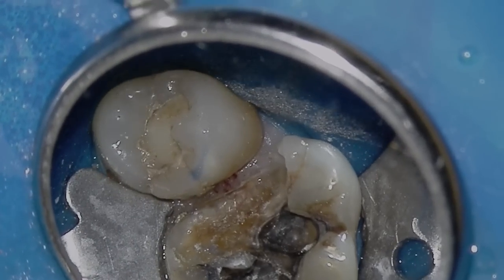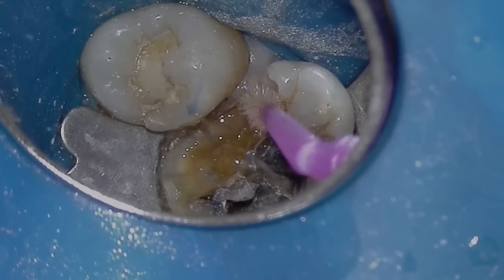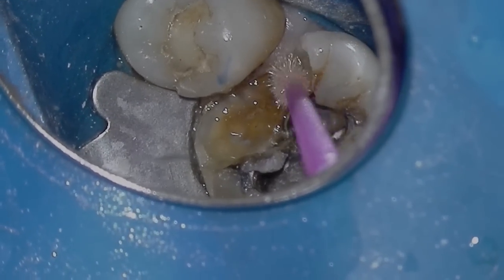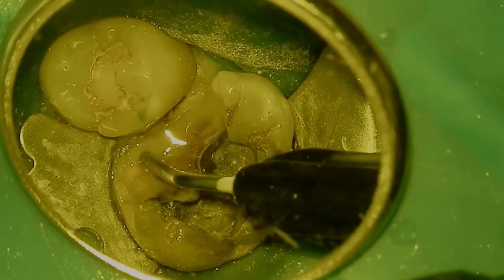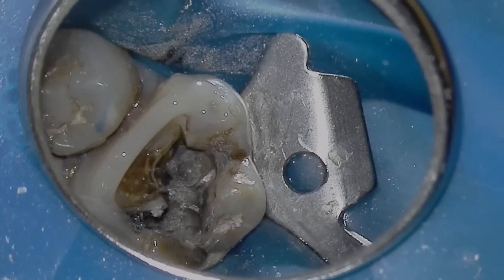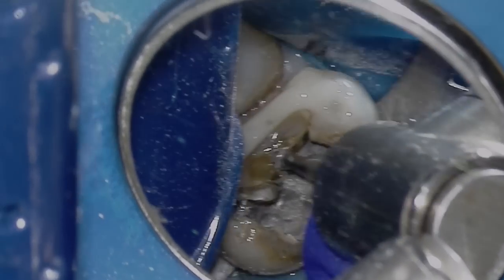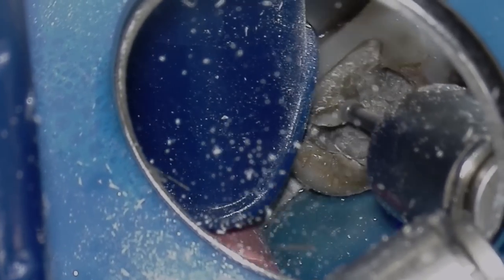We decided to quickly build up the tooth using a layering technique. This is one of those situations where even though the restoration is being removed, you think you should have taken the extra two minutes to put in a sectional or Tofflemire band to build it up quicker. But we're ready to start our endo access, and the reason I wanted to put that layering technique on there is to contain our irrigant.